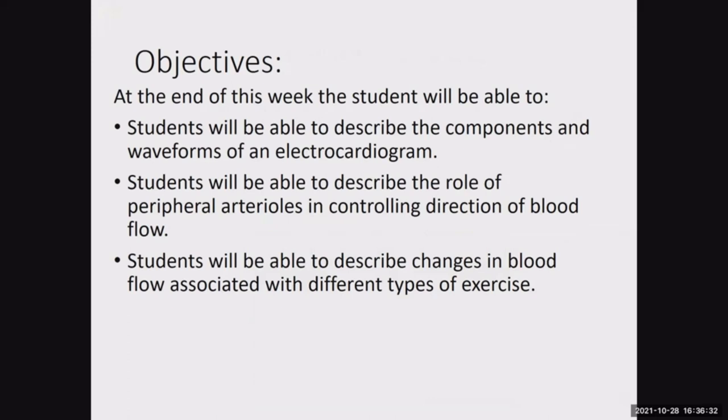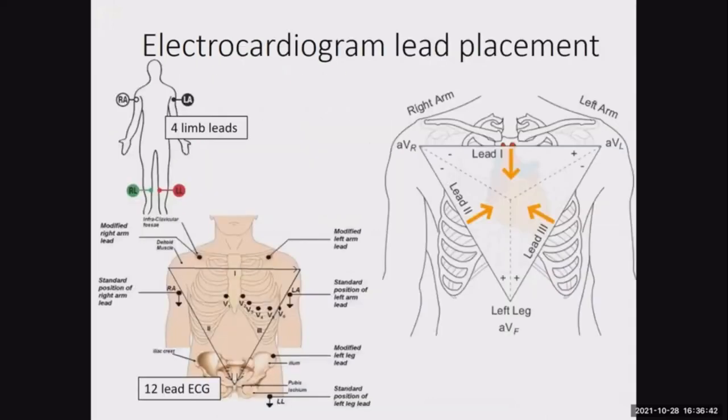As always, there is a set of objectives to help focus on what we feel are important in the activities that we're doing this week. This week, we're going to be looking at cardiovascular system functions. We'll start out looking at an electrocardiogram, an ECG, previously known as an EKG.